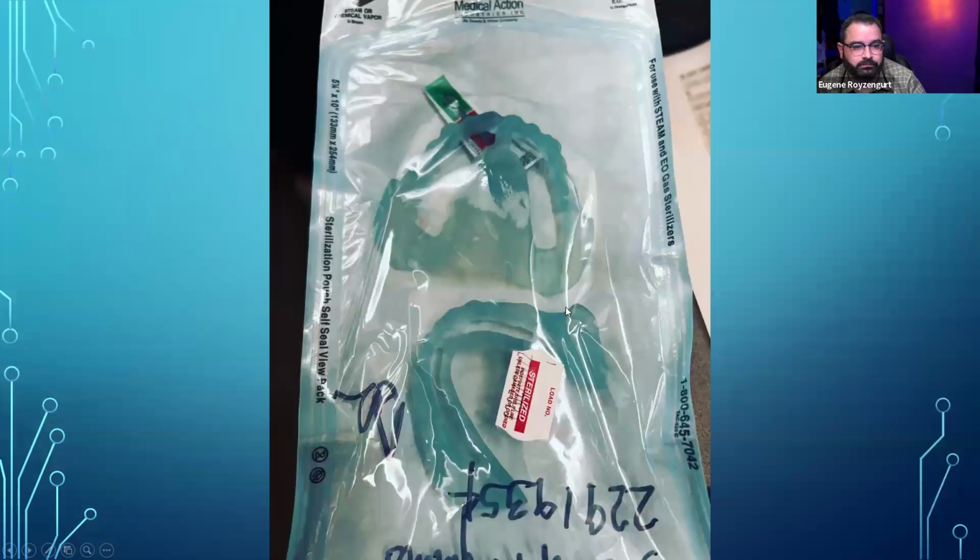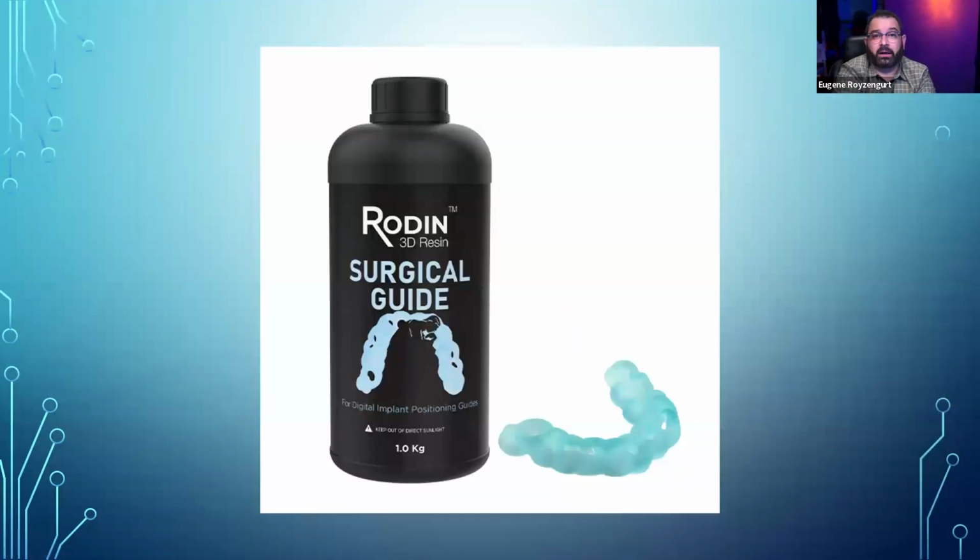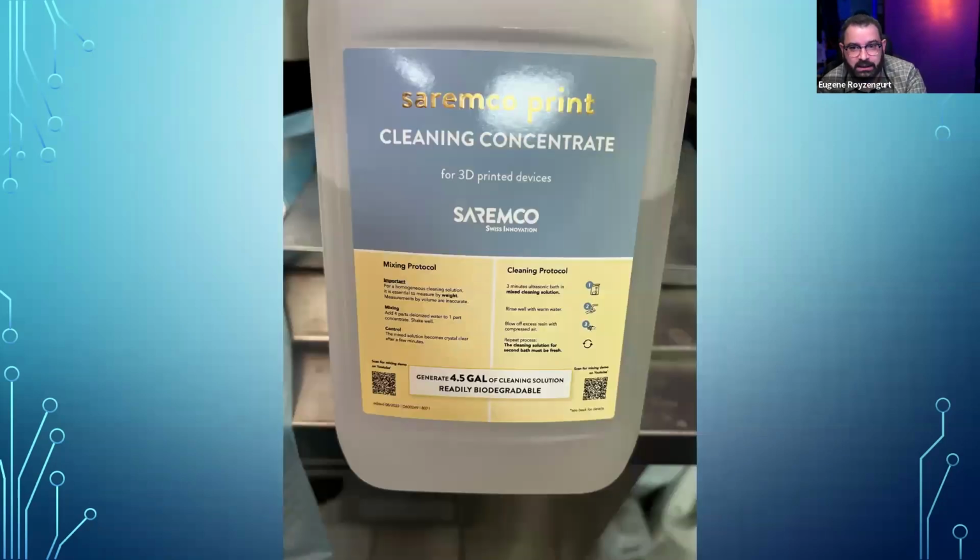And for that, I use the Pac-Dent Rodin, sorry. Some people say Rodin, some people say Rodin. Whatever works, I guess. This is what I use for my surgical guides. I've actually used this resin for some 3D splints as well. And it worked out pretty well. All right.